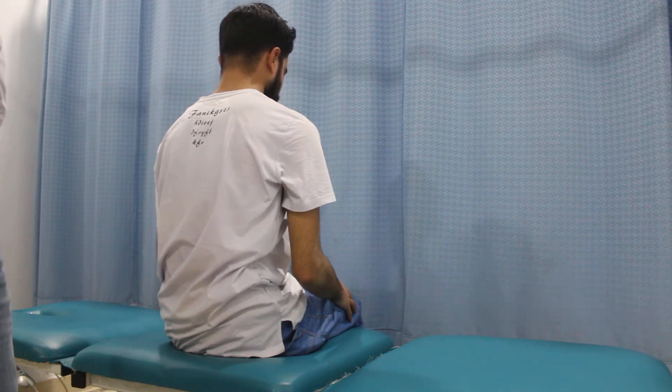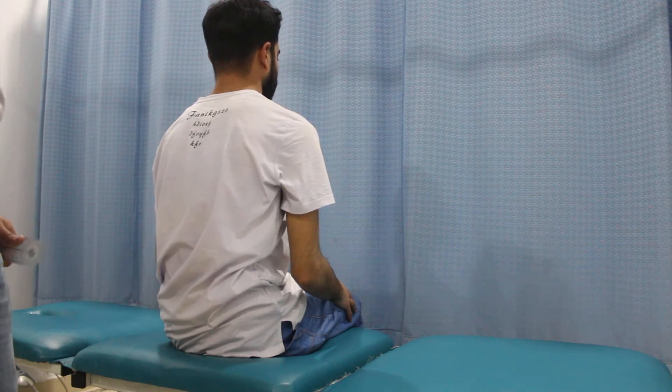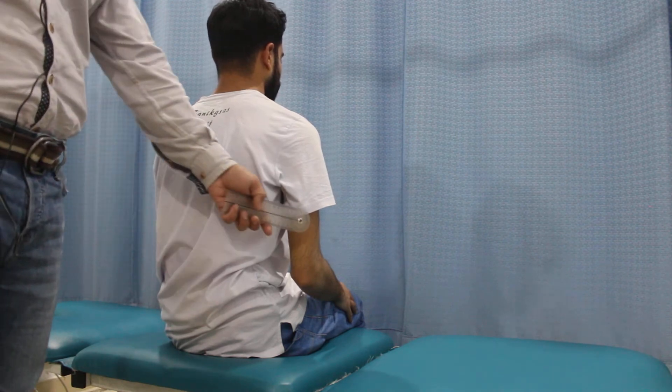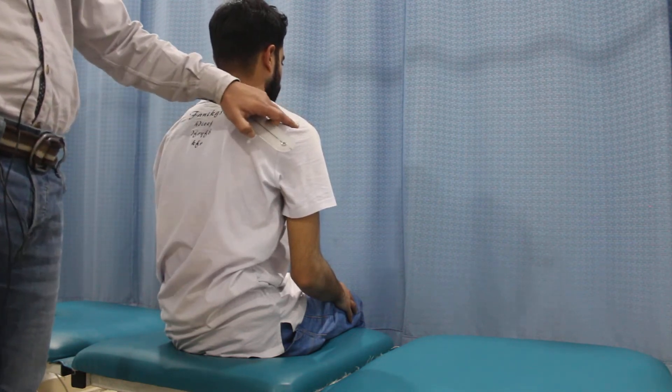Today we'll be discussing how to measure the shoulder abduction range of motion using the standard or universal goniometer. The moving bone is the humerus, the fixed point is the trunk, and the joint or the fulcrum or the pivot is the glenohumeral joint.